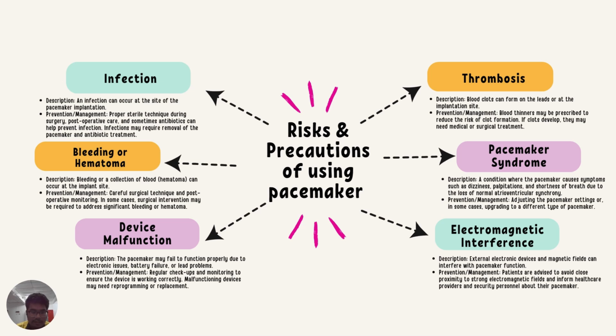Okay, now I, Leo Banu, will be explaining about the risks and precautions of using a pacemaker. So, I have listed around six risks and precautions we have to follow.